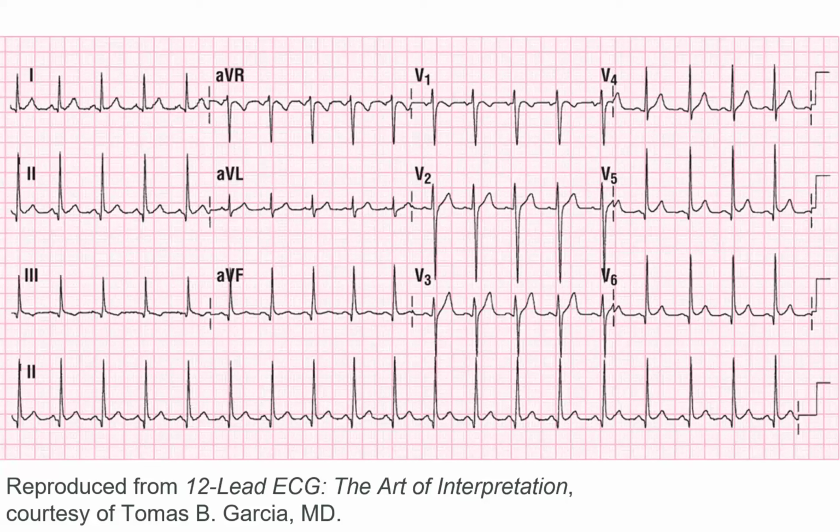So in the inferior leads, any combination, you have to have two elevations. Yep. V1, elevation, depression, or neutral? Really neutral. It has an inverted T wave. Not sure why that is, but it's neutral. V2, need 2 boxes here. No, I'd say we might have our 1 box of normal average elevation there, but we don't necessarily have 2. V3, need 2 boxes here.